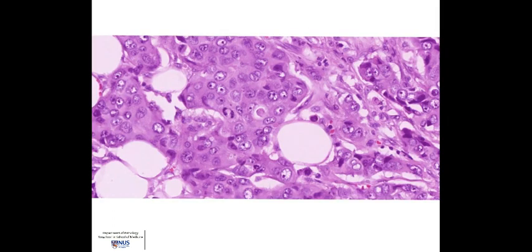At high power, we can look for the other two parameters of grading, namely nuclear pleomorphism and mitotic count. In this image, we see marked nuclear pleomorphism — the nuclei are of different sizes and shapes with prominent nucleoli. In the middle, there is a mitotic figure. The more mitotic figures seen, the higher the grade of the tumour.